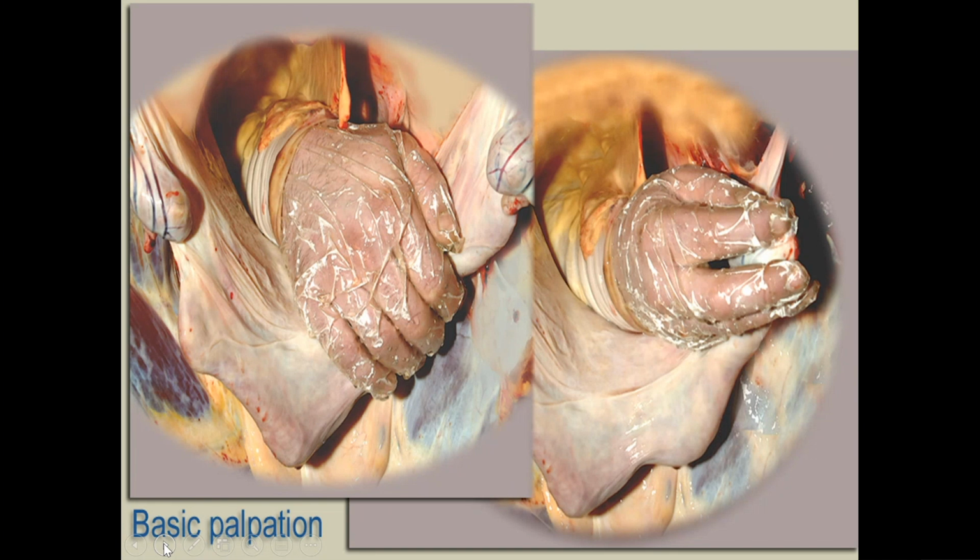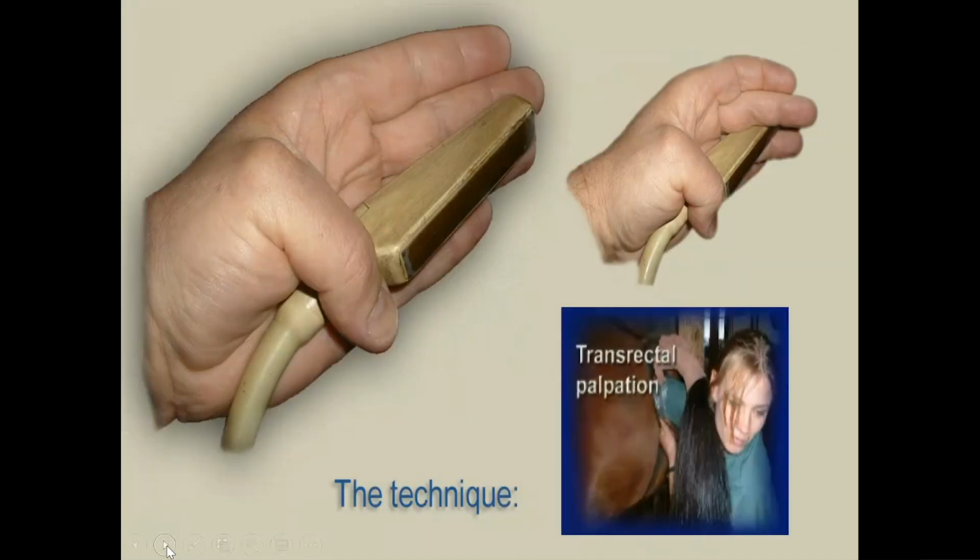So a thorough rectal palpation always should precede your ultrasound exam. The ultrasound exam itself, this is quite an old transducer in the picture here. It was one of my favorite back from many years ago. It sits nicely in the palm of your hand. You can see I fold my thumb over the transducer cable, which sort of anchors it in place. And note that the tips of my fingers are in advance of the rectal ultrasound transducer.